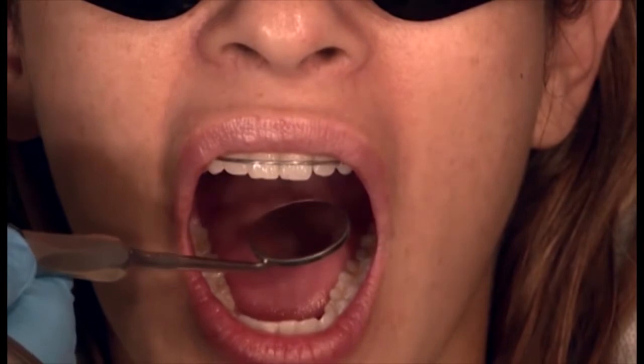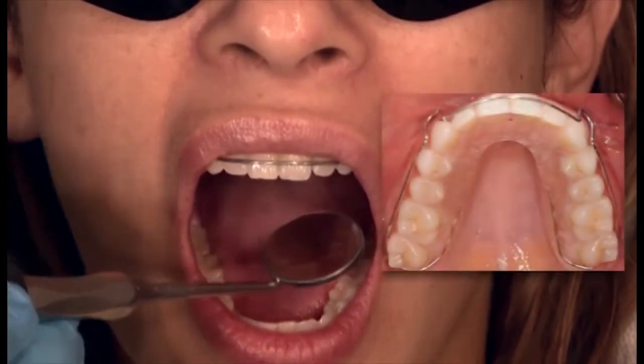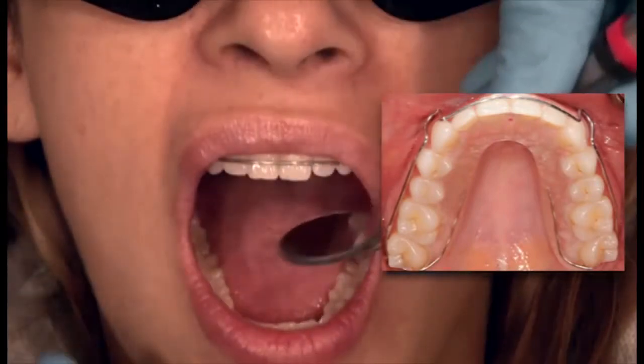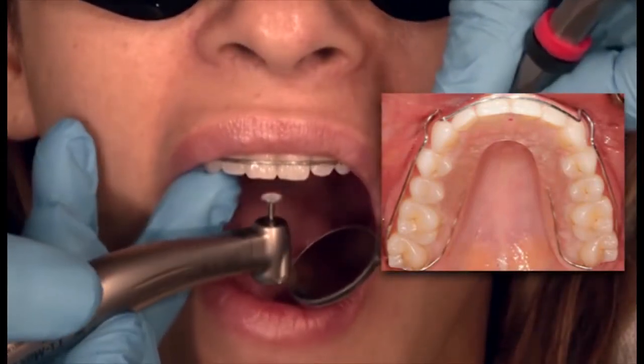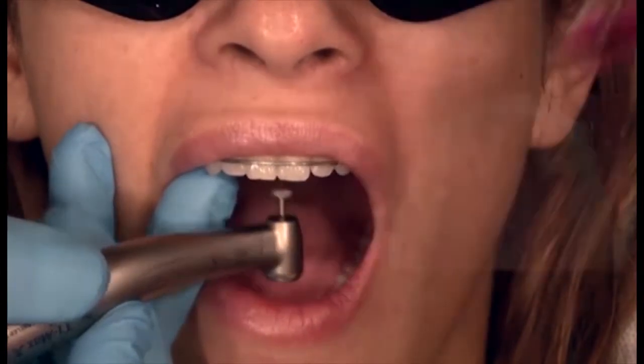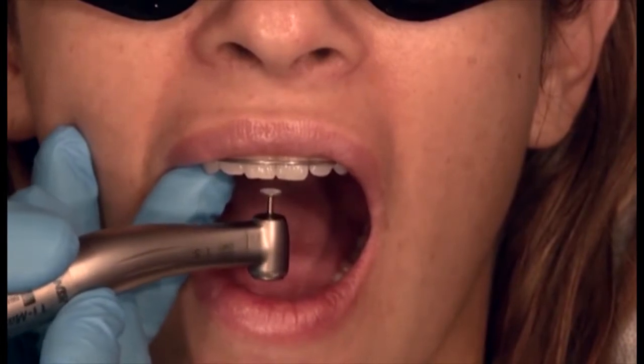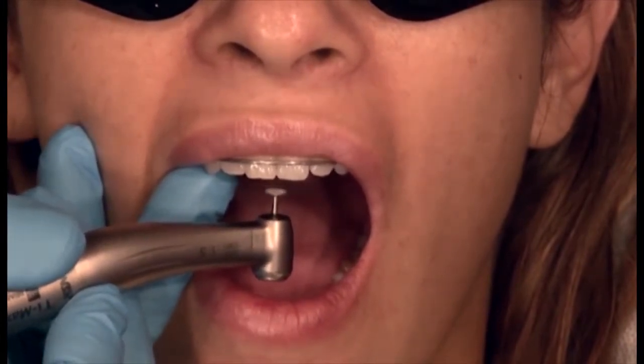That spot is the confirmation of the deprogramming. As long as that spot can be validated the way we've talked about before, and that's already been done, Katrine has already gone through the deprogramming phase. So the equilibration technique begins by reducing this spot.